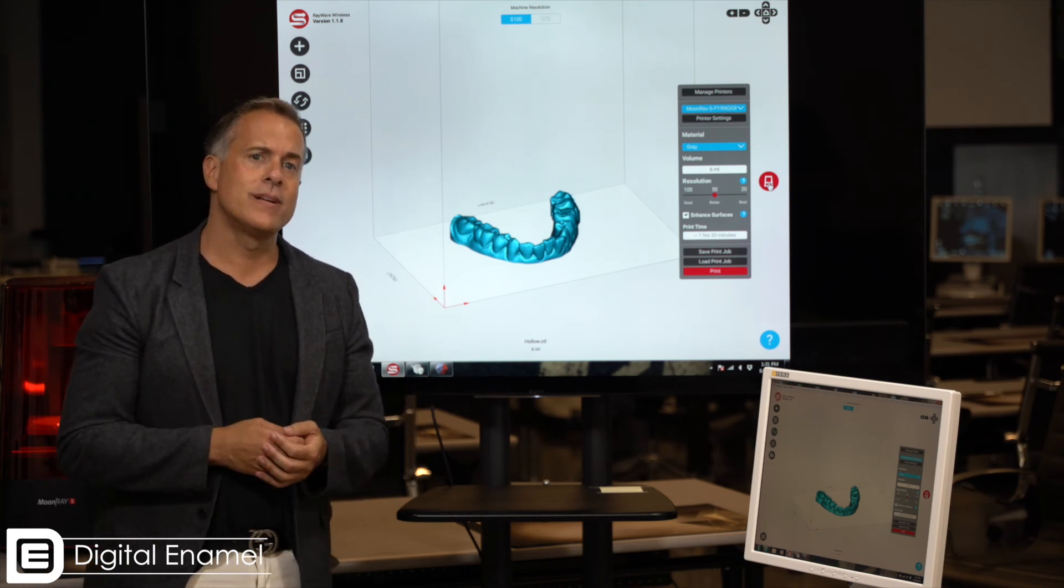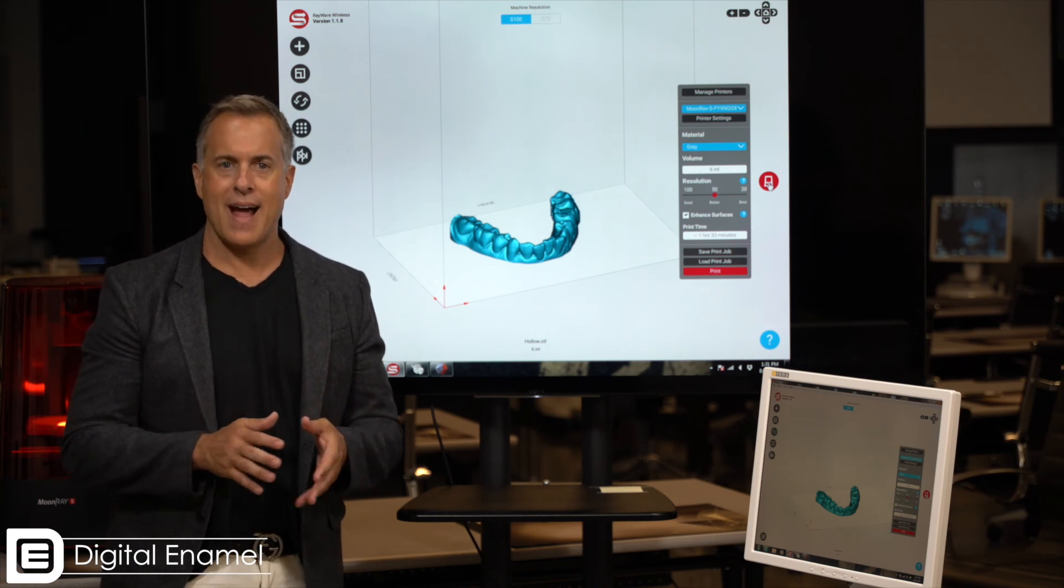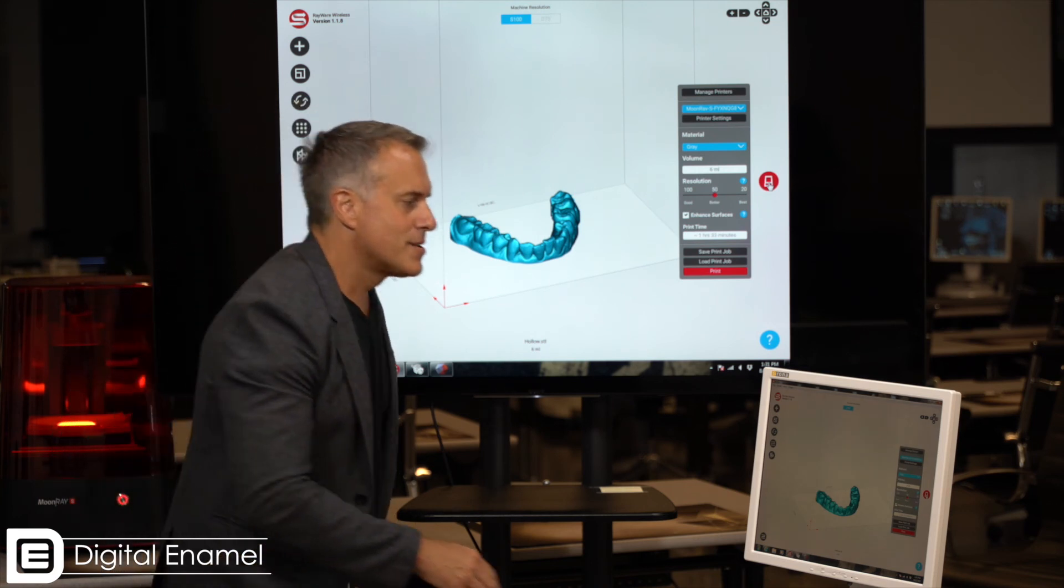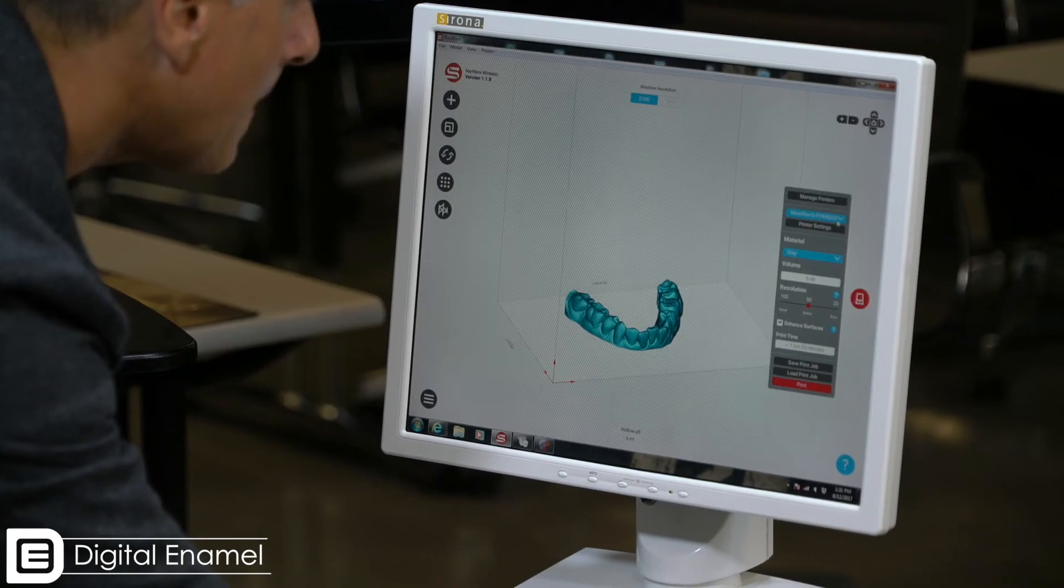In this case, we're going to print it out in the nice gray model material they have. So we go ahead and select that.